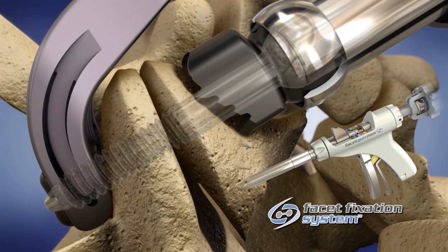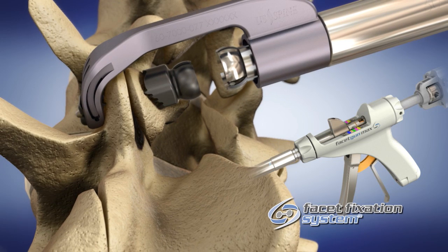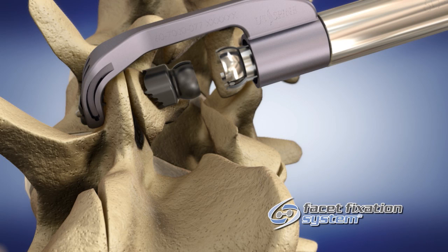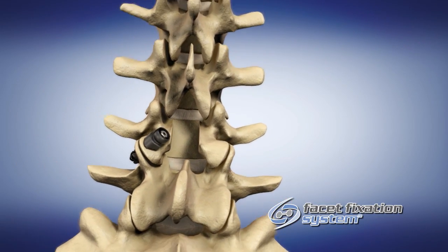Disengage the screw from the driver shaft by rotating the screw retainer knob counterclockwise until it spins freely. Release the clamp by depressing the clamp release button and simultaneously pull backward on the roll controller at the top of the handpiece to disengage the proximal washer from the end of the barrel. Finally, apply force perpendicular to the length of the barrel to disengage the distal locking washer.